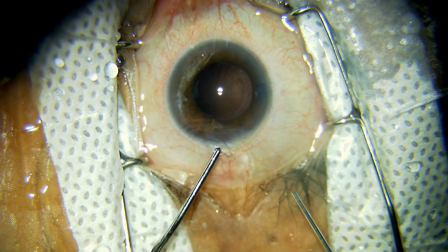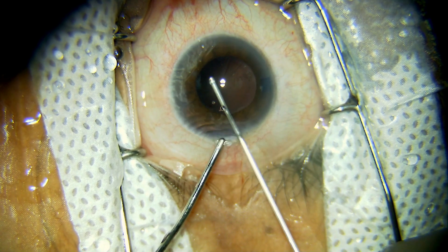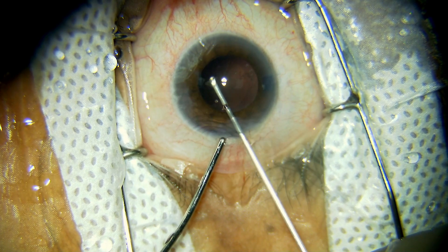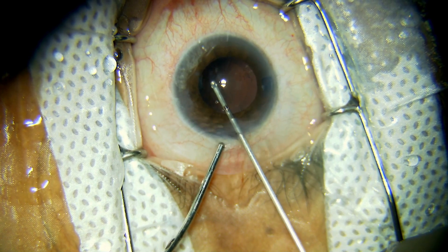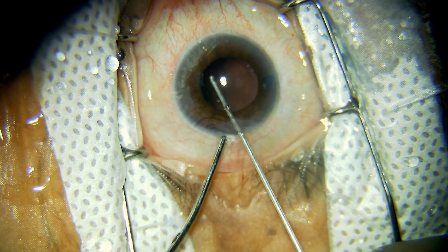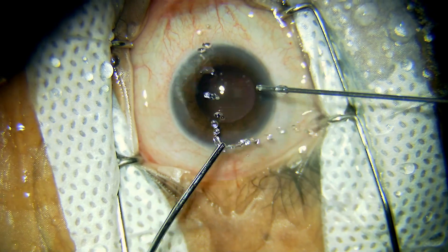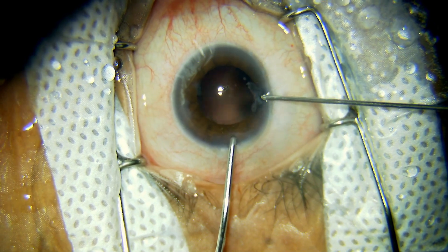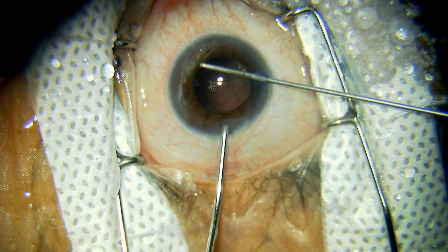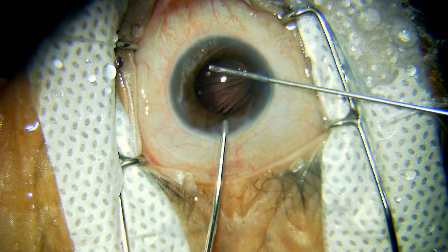A very small fragment has gone into the vitreous. Anterior vitrectomy is now being performed with the help of the cutter and the irrigation from the main port, depressing the posterior lip and doing the anterior vitrectomy. The small fragments can be seen coming out from the vitreous into the port of the cutter. The remaining vitreous is being removed with the cutter from the side port while depressing the main wound.